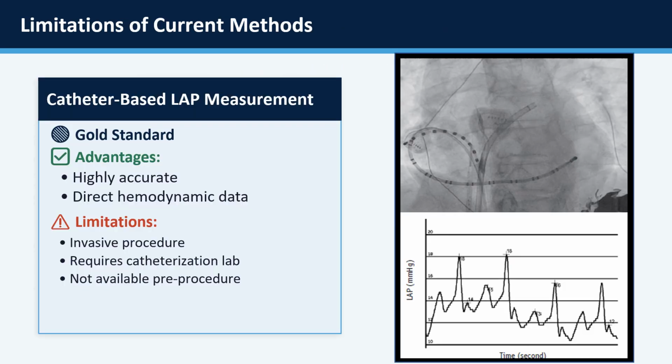So you can have a question: how is LAP measured in clinical practice? The gold standard is a catheter-based measurement with the transseptal puncture of the heart. Even though it is very accurate, this approach is very invasive. So this inconvenience motivated our study.